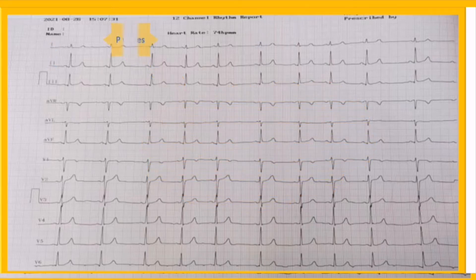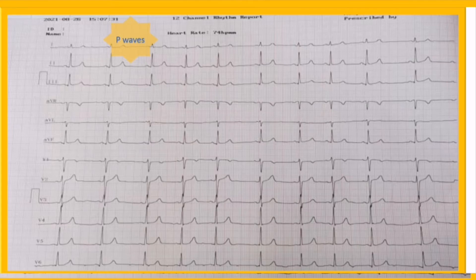The next step is examination of the P wave. P waves and QRS complexes are helpful in discovering heart rhythm and many other structural and non-structural abnormalities. That's why we examine P and QRS twice — once for axis determination and again for other abnormalities in detail. The P wave represents atrial depolarization.